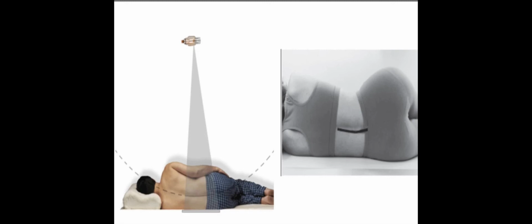But you have to know that while the patient is lying that way, there's a sagging of the vertebral column towards the IR. This is because of the lateral flexion, or the spine may be straight but tilted at an angle with the IR.